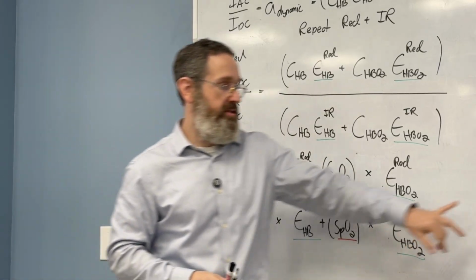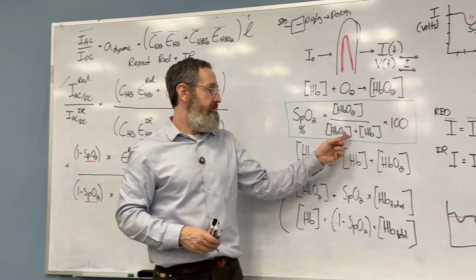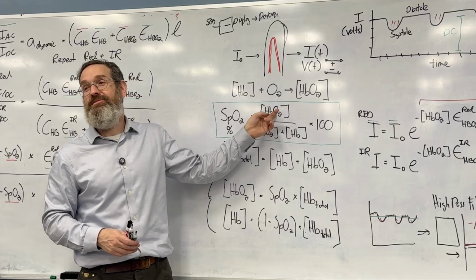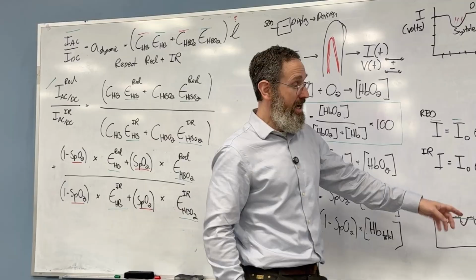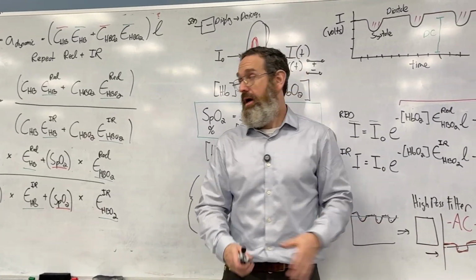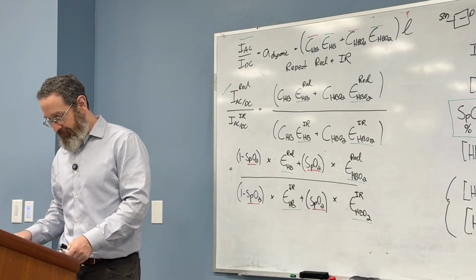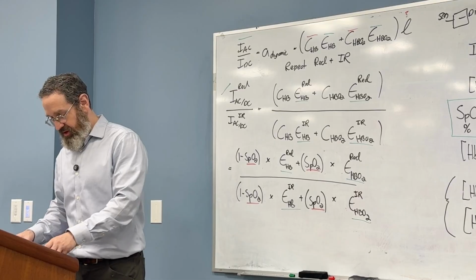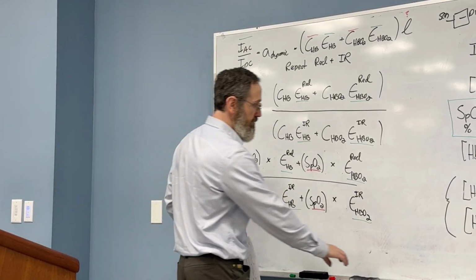That's why I had to hold this here. A pulse oximeter doesn't know Emily's oxyhemoglobin concentration, but it doesn't need to. Is this what an actual pulse oximeter does? It does. An actual pulse oximeter takes a ratio of a ratio. Now, there are 2 more equations I need to show you.